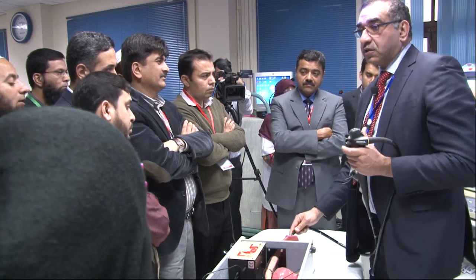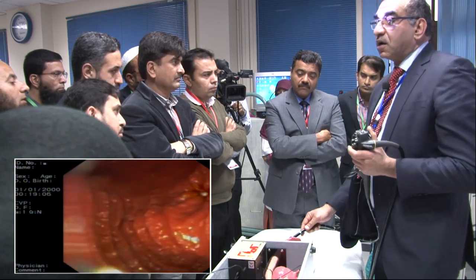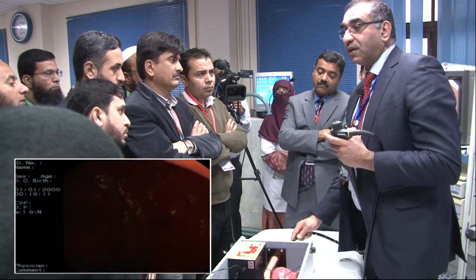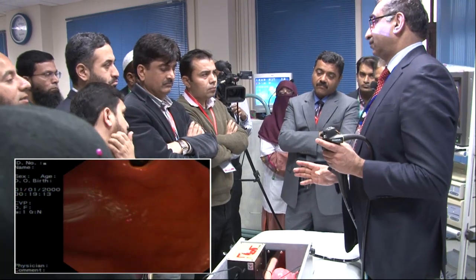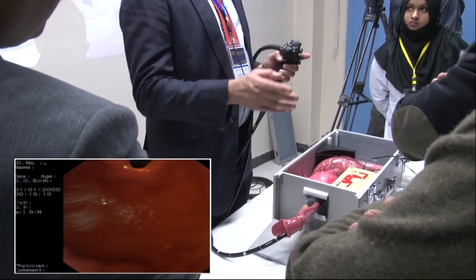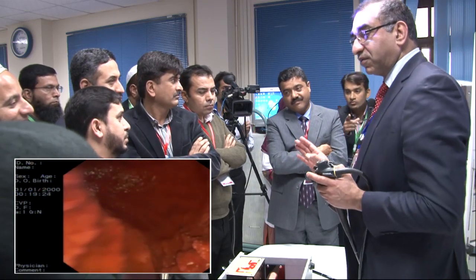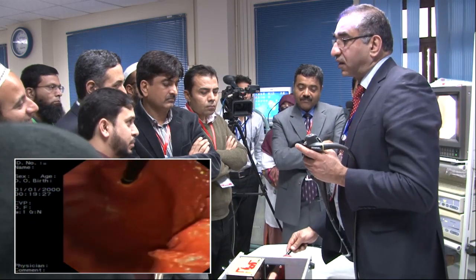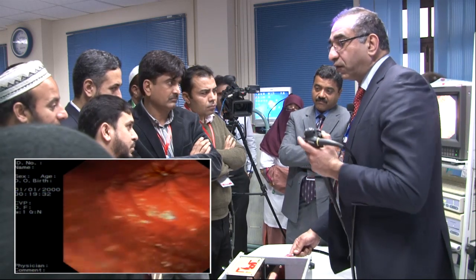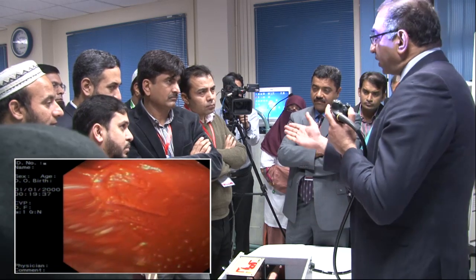Right, okay. Generally, when you get into the stomach, it's always a bit tough here. Usually with most of the trainees I find, when they are in the stomach, they go like that. It's typical. Whether the trainee is from Pakistan, America, England, or Saudi Arabia, they all have a tendency to go like that. That's what you shouldn't do. When you go, look at the rugae, the folds of the stomach, and just follow that. And the other thing is, when you are traversing the stomach, bear right.